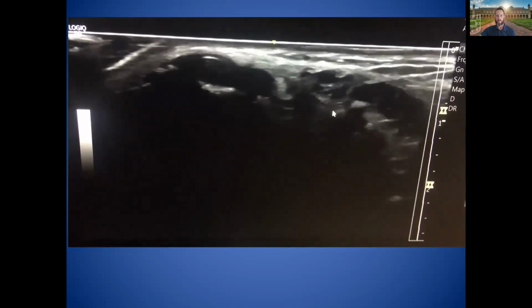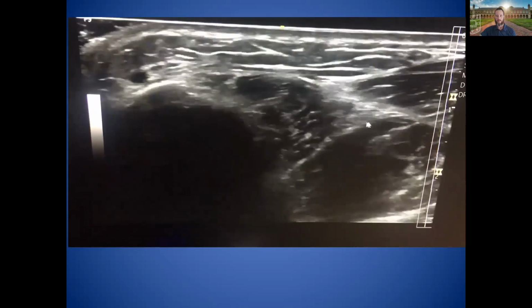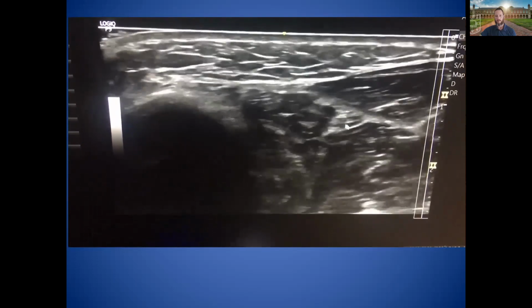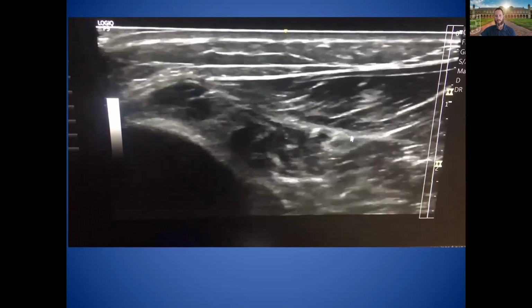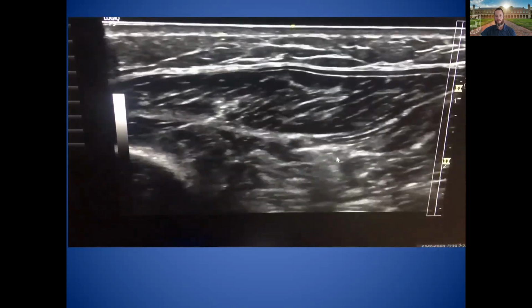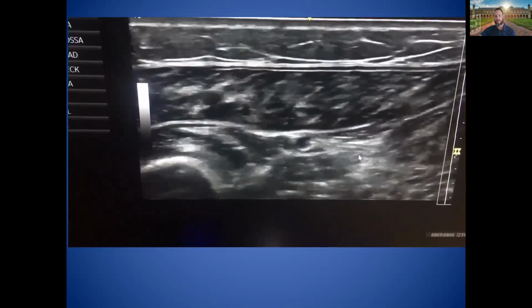Now I'm going to move back proximally, and here you can follow the tibial nerve, which remains in close approximation to its artery, the posterior tibial artery, if I remember correctly. And Becky, just show where I am here. So this is the approach for following the tibial nerve through the distal leg, is to have the leg in this external rotation at the hip so that you can image it here from the side.